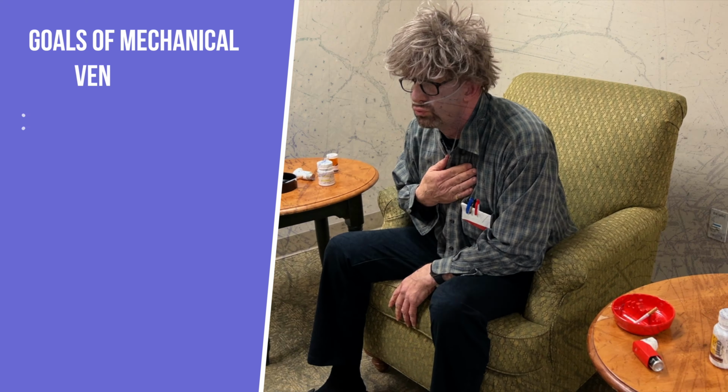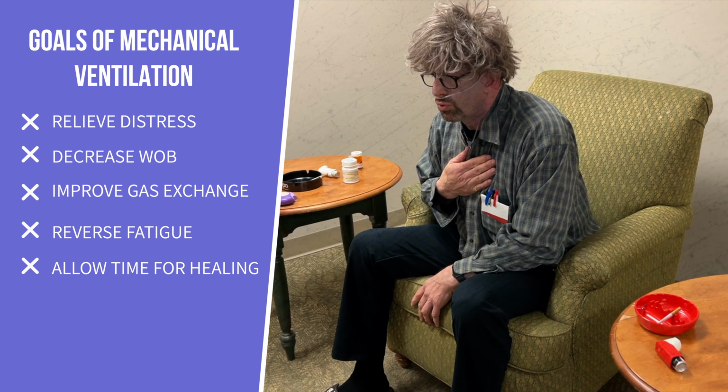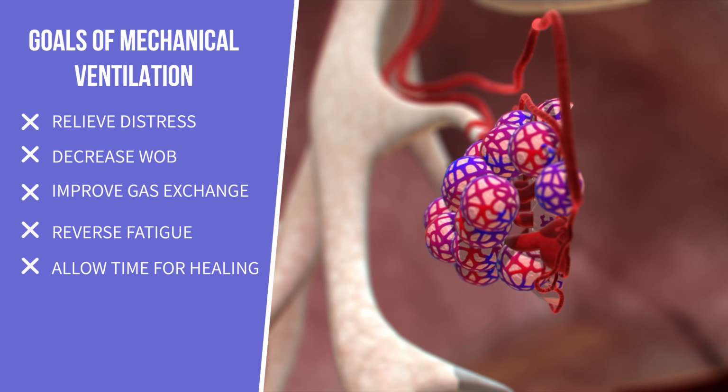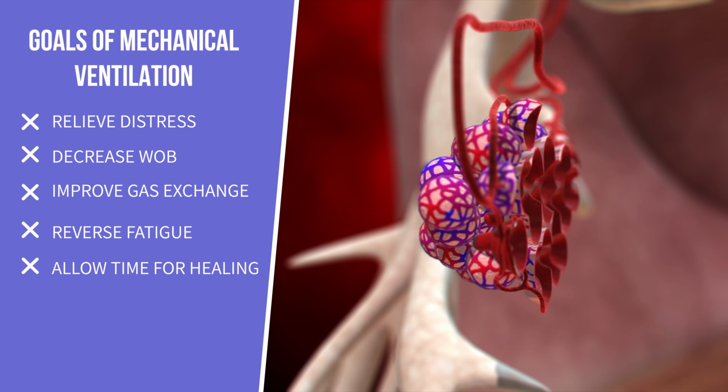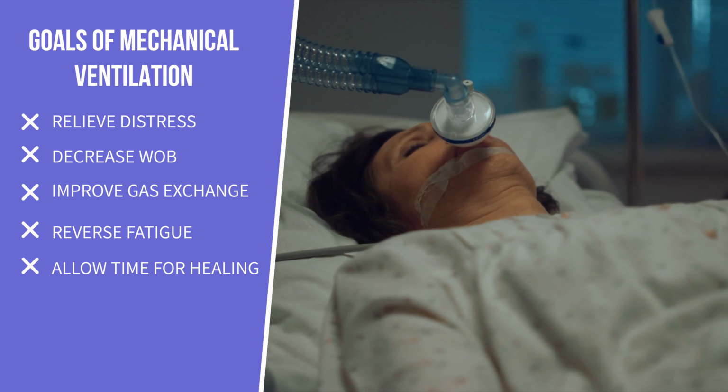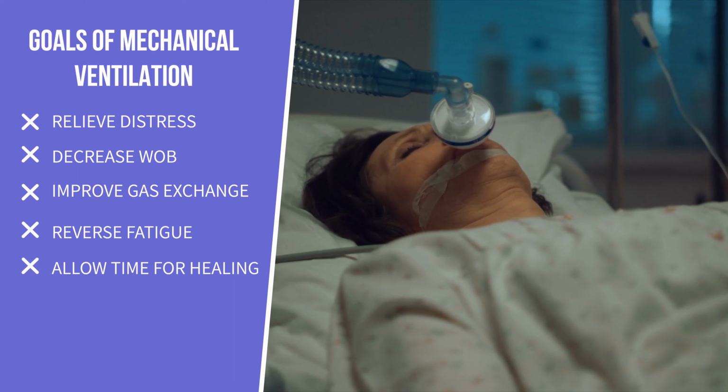The primary goals of mechanical ventilation are to relieve respiratory distress, decrease the work of breathing, improve gas exchange, reverse respiratory muscle fatigue, and provide time for healing of the lungs.